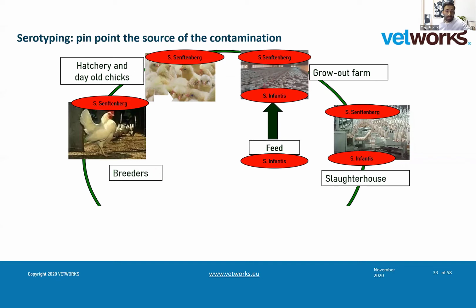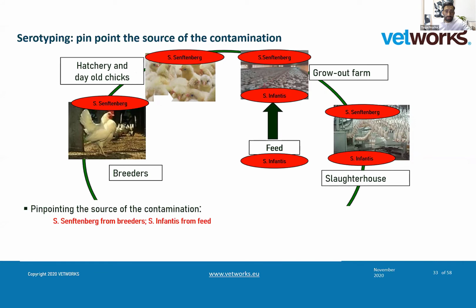So this is just an example of the efficacy of a monitoring program if you do this kind of monitoring and serotyping in your program. So every step of production should be monitored, to allow us to trace back each contamination.